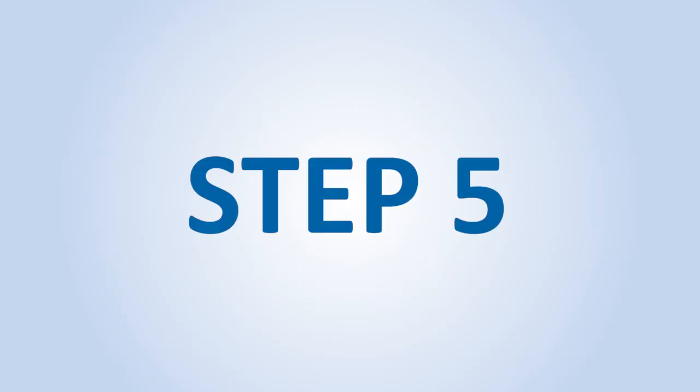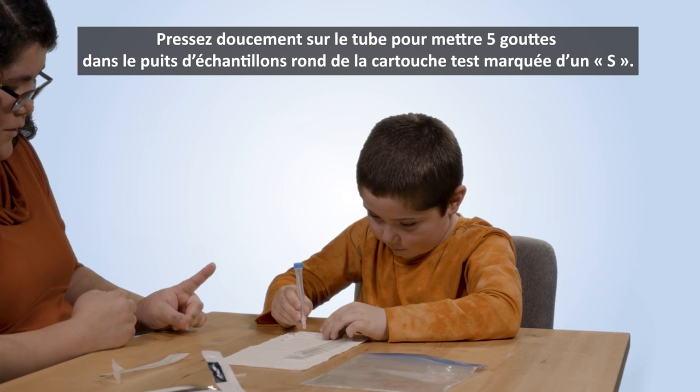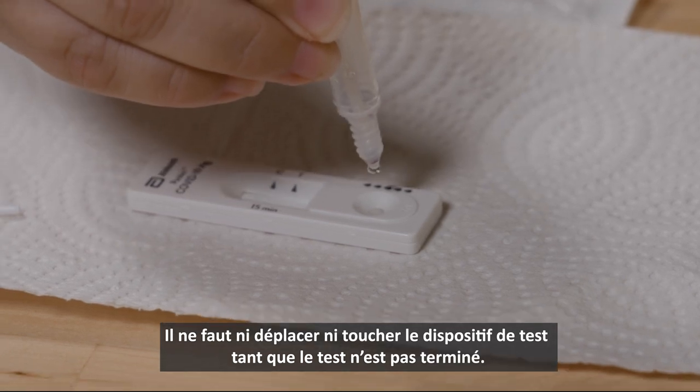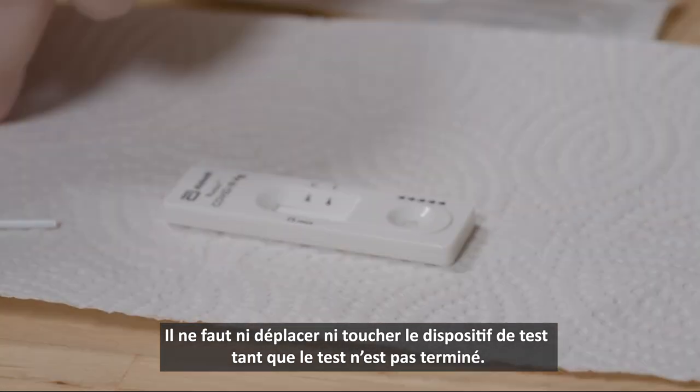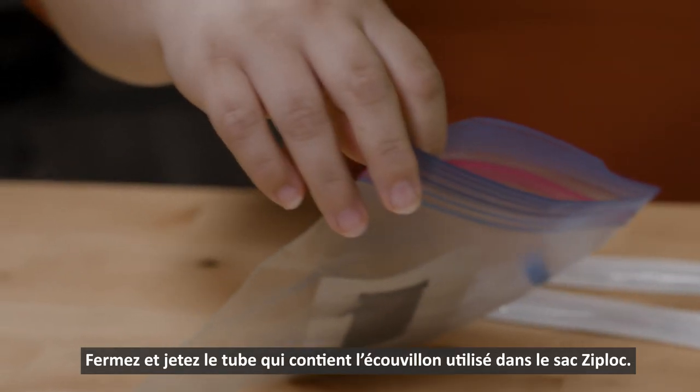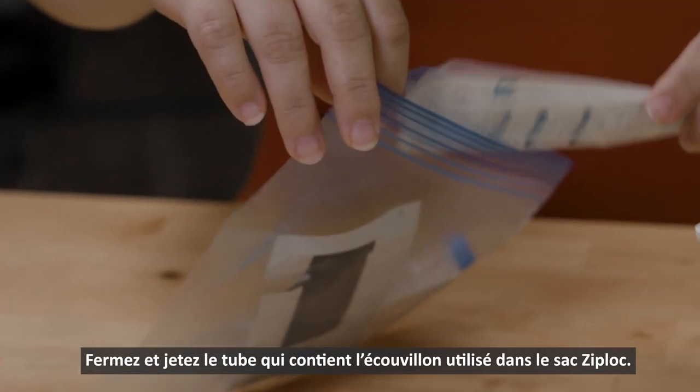Step 5. Gently squeeze five drops into the round well of the test cartridge labeled S. Do not move or touch the test device until the test is complete. Step 6. Close and dispose of the tube containing the used swab into the ziplock bag.